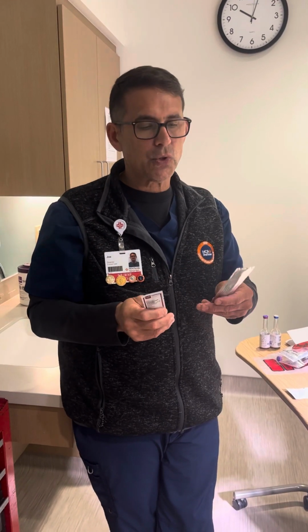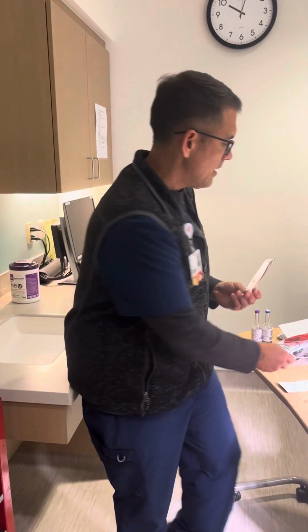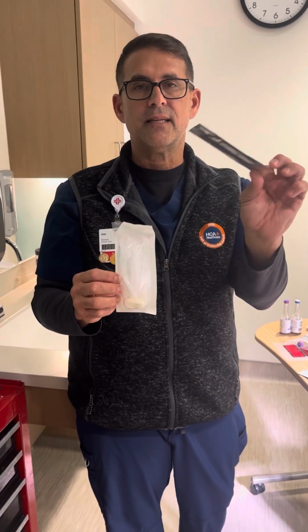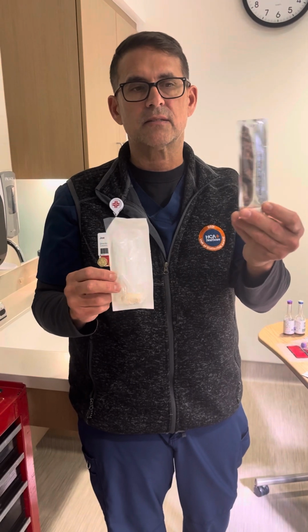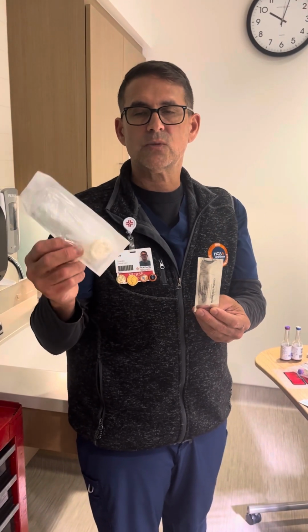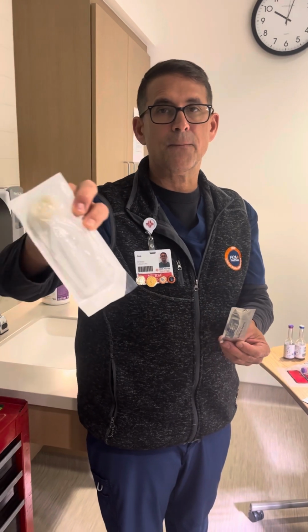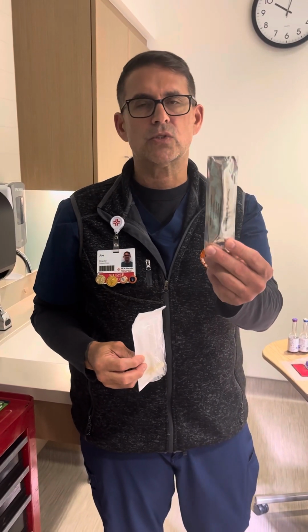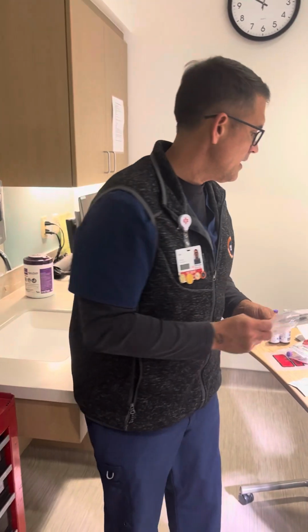Anybody older than 2 is going to use these little swabs. They can also use these. These are both chlorhexidine. These are going to be stocked sometime next week. In peds, I don't think we have them yet, peds and PICU. These we have right now. You can use both of them. Notice how big that is. That's a lot for a 3-month-old. So we're going to have these swabs. This is what we do use on adults. You don't need anything bigger than this.